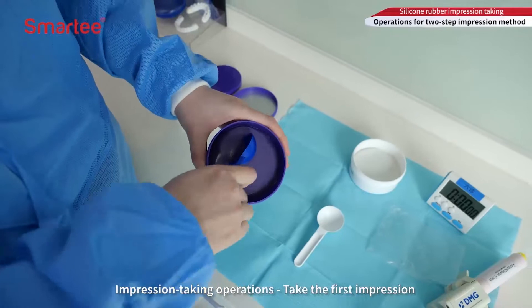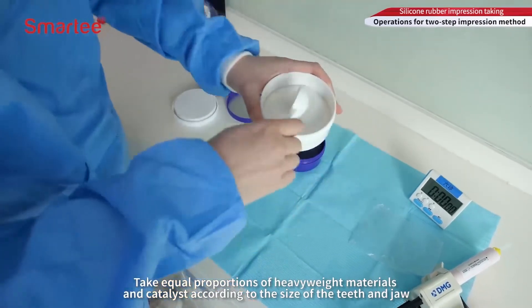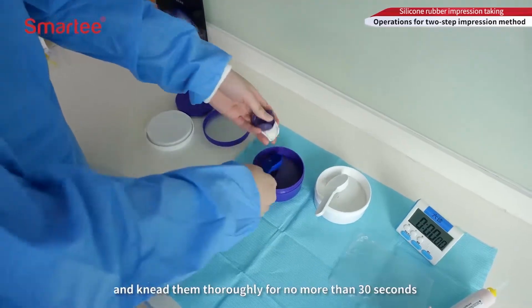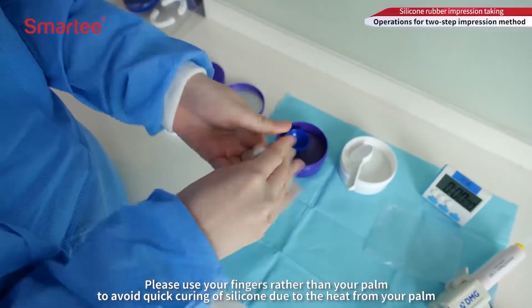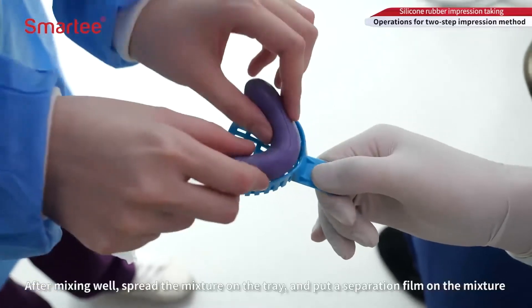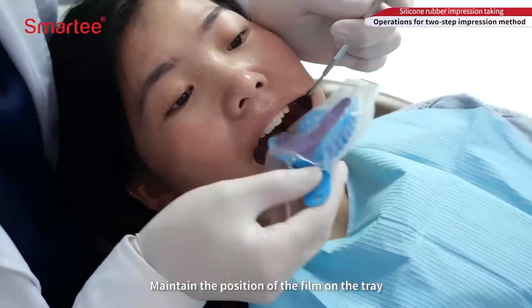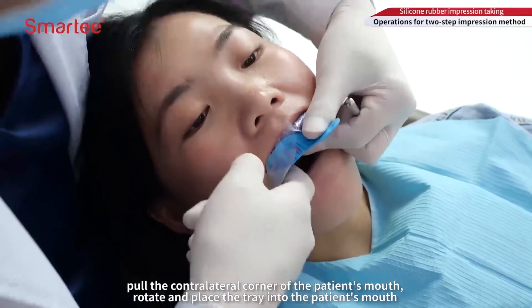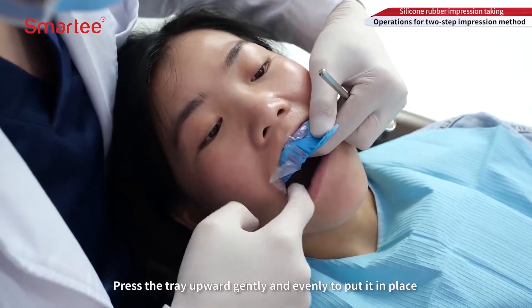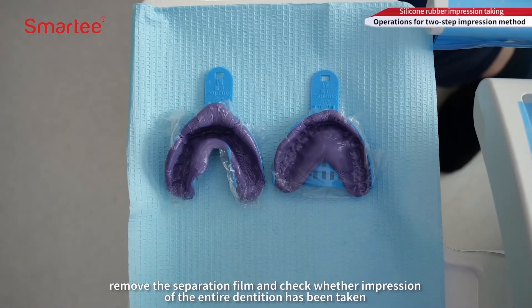Take the first impression: take equal proportions of heavyweight materials and catalyst according to the size of the teeth and jaw, and knead them thoroughly for no more than 30 seconds. Use your finger rather than your palm to avoid quick curing of silicone due to heat. After mixing well, spread the mixture on the tray and put a separation film on the mixture. Pull the contralateral corner of the patient's mouth, rotate, and place the tray into the patient's mouth. Press the tray upward gently and evenly to put it in place, then take the heavyweight materials out after curing. Remove the separation film and check whether the impression of the entire dentition has been taken.